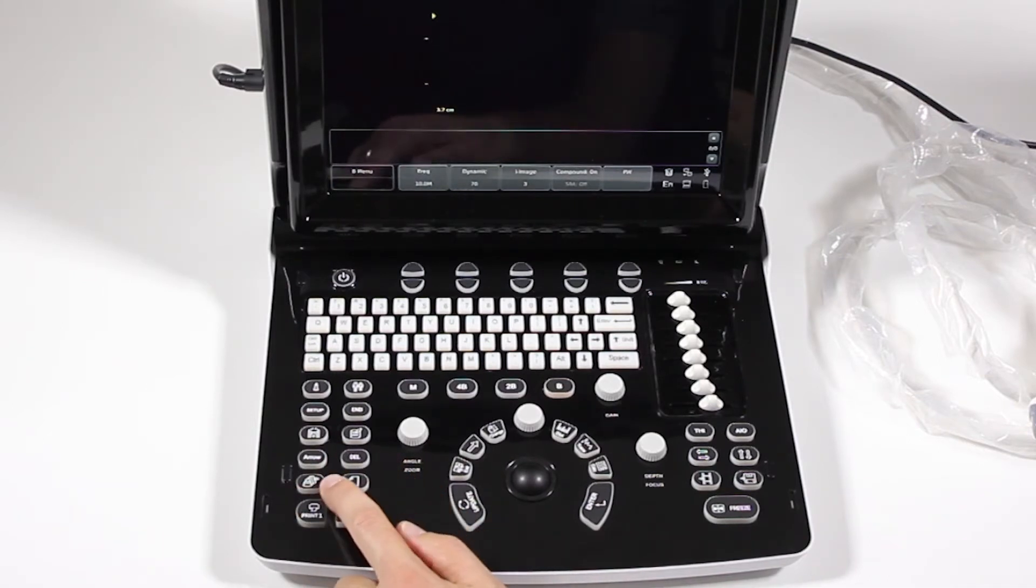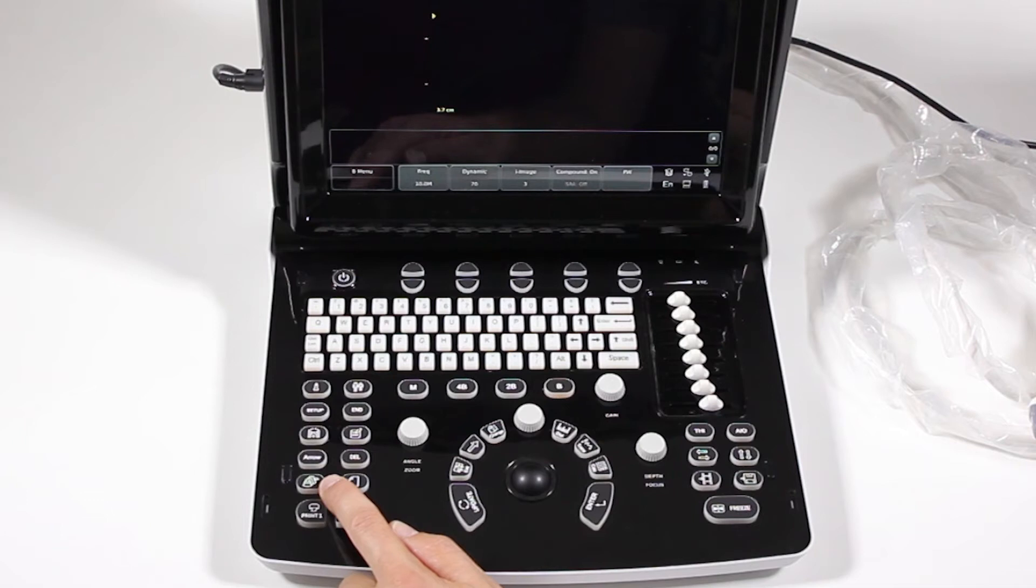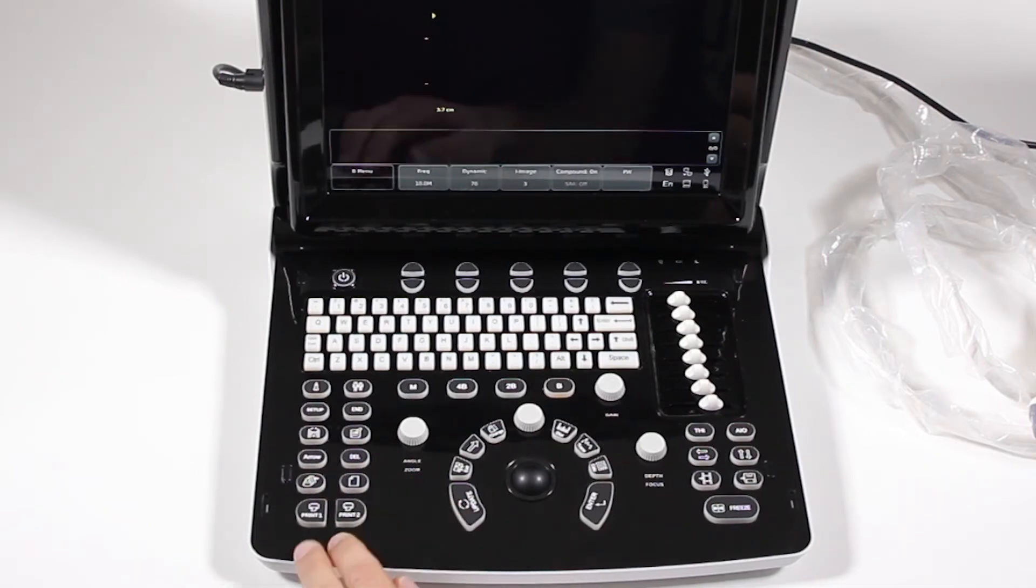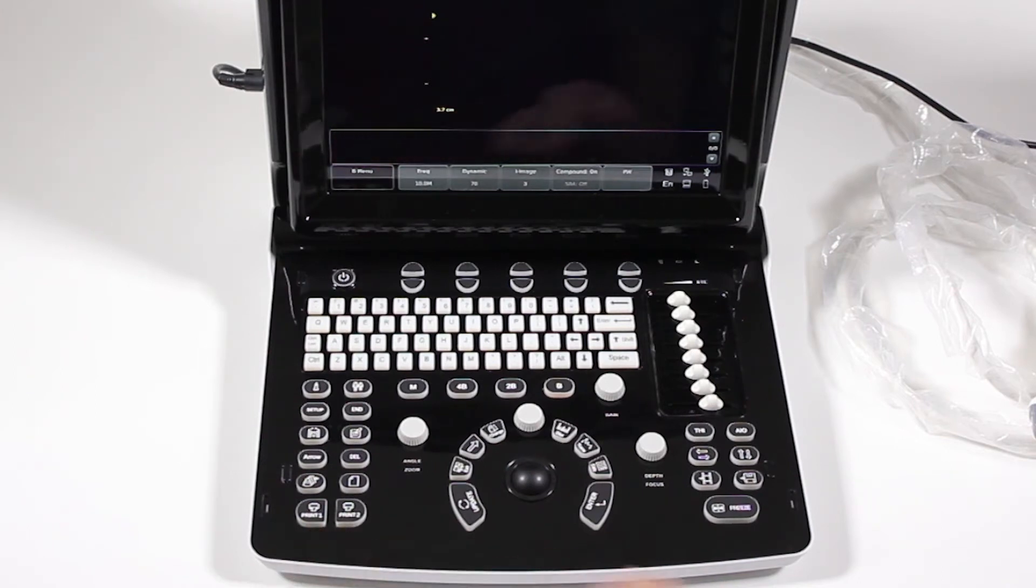Our archive button, where we'll look at previous images, either for a current exam or past exam, so you can either export them to DICOM, save them to USB, or just review them in general. Here's your report button, and there are two assignable print keys here for a black and white color printer or whatnot.